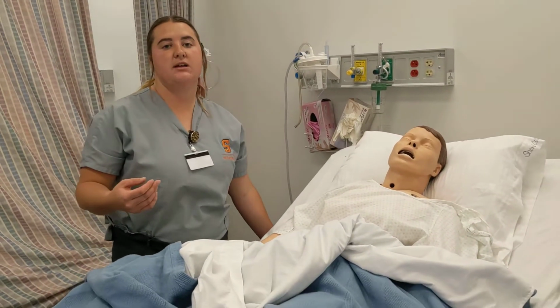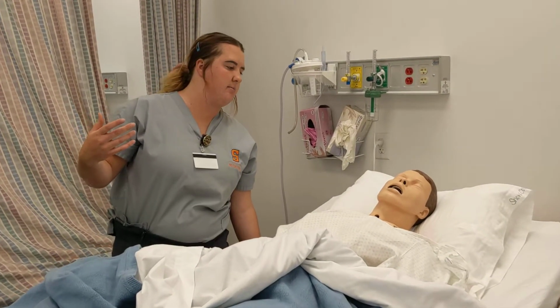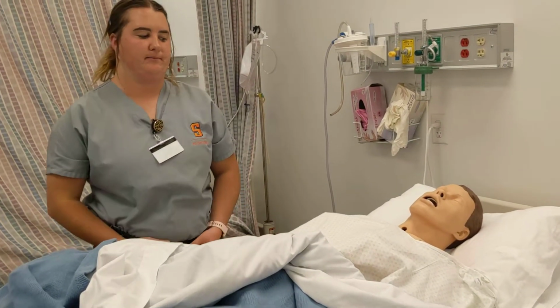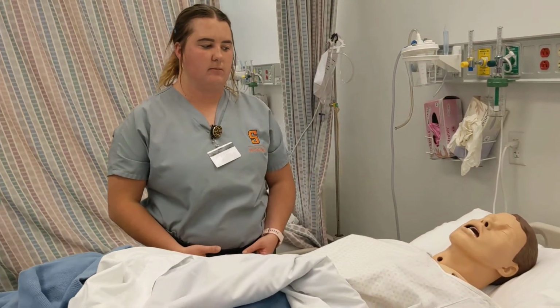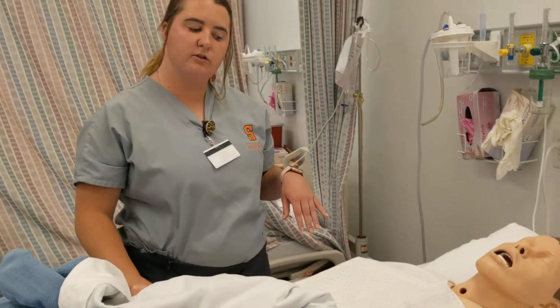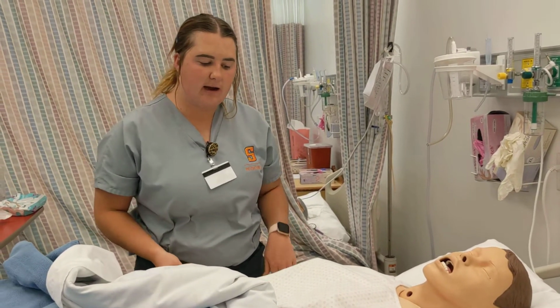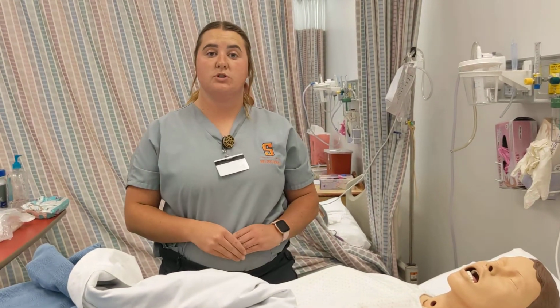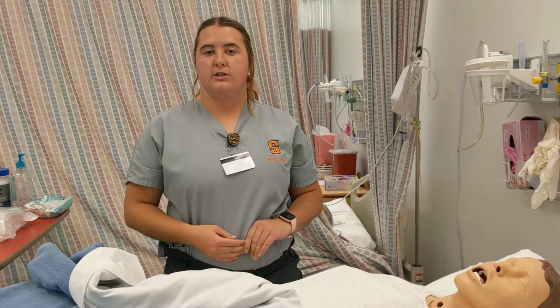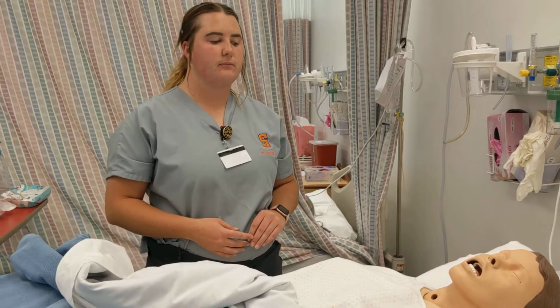And as I'm in here, of course I would introduce myself if needed, but since I have been in here for the last 20 minutes, the patient still recognizes me. But I would, if I needed to, reintroduce myself. And we've already done all the beginning steps, but when I was out there, I would check my order and ensure that we needed a Foley catheter, which it does. It says stat, so we need to put a Foley catheter in right now.